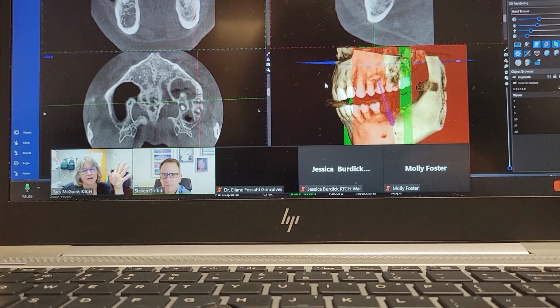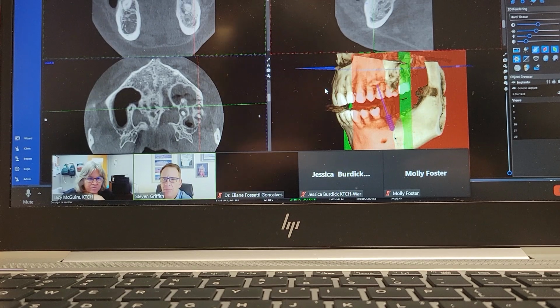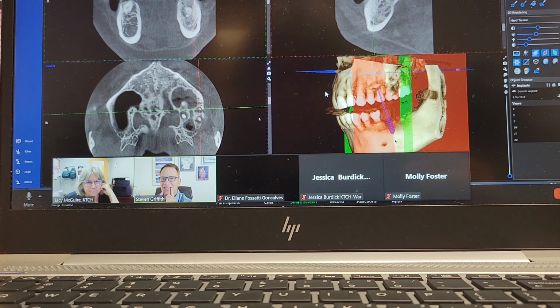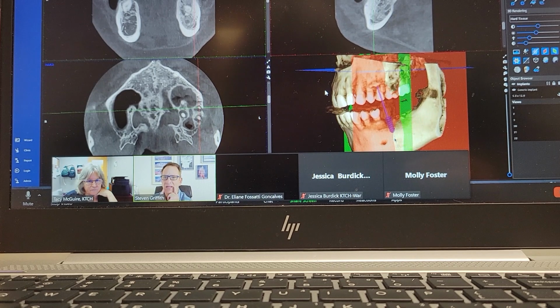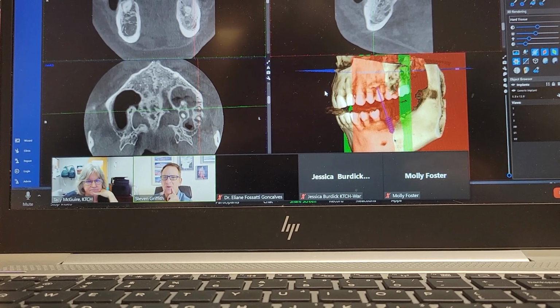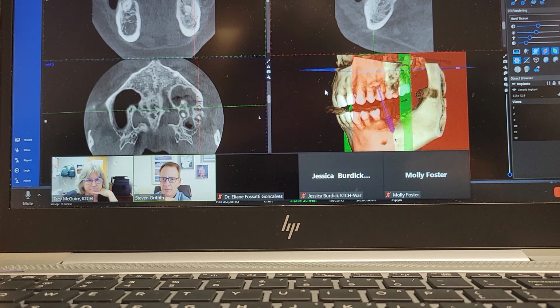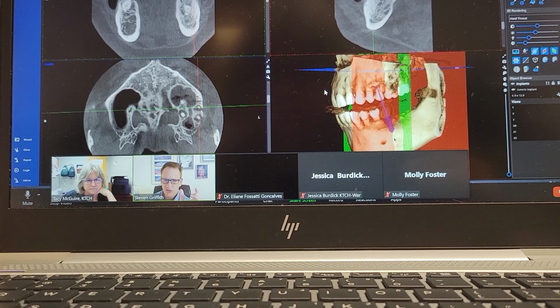It seems like sometimes we have fuzzy premolars. Yep. And here's the thing. If you've got fuzzy premolars, a lot of times that person's more of a square jaw person, and you've got it set in a horseshoe. If you notice on the screen when you're doing it, there's a little horseshoe button.